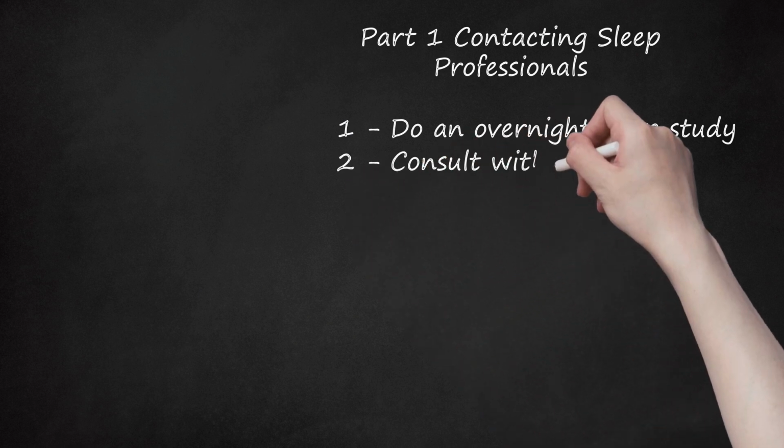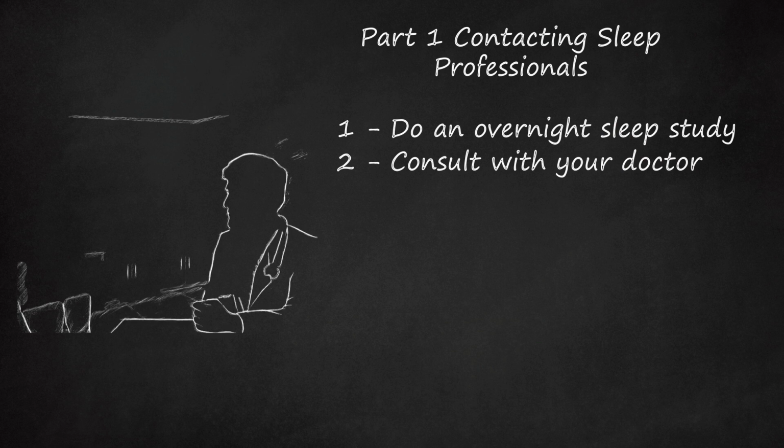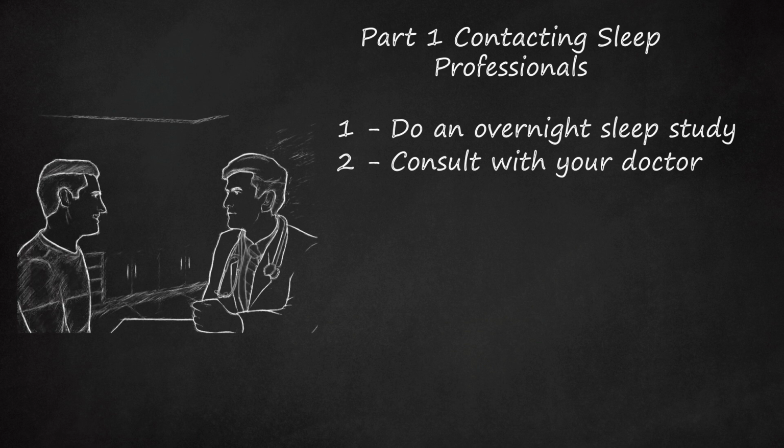2. Consult with your doctor. Doctors and manufacturers recommend that the air pressure settings of your CPAP machine be personalized for you by a medical professional based upon a titration study at a sleep clinic. You should then use those recommended settings for at least a few weeks to get used to them at night.